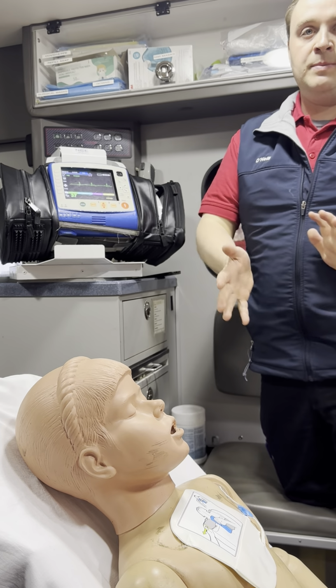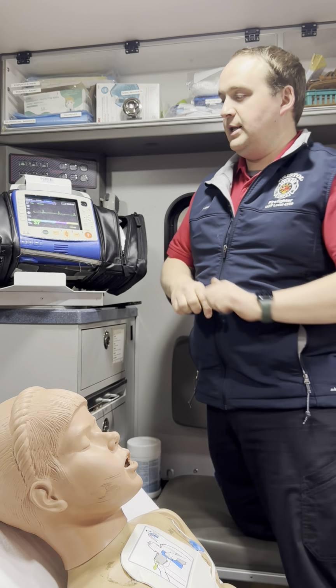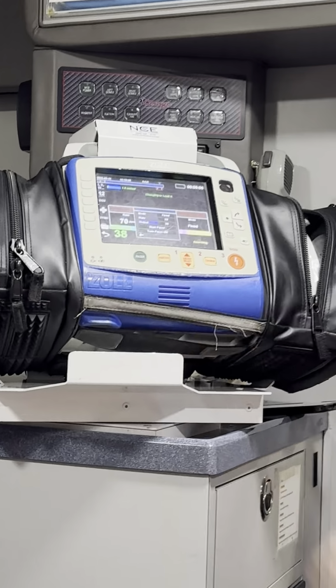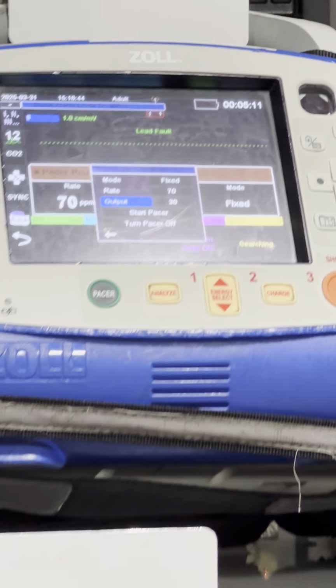Very important, when we're pacing, we have to have at least the 4-lead monitor connected to the patient. It doesn't have to be a full 12. The 4-lead provides feedback to the monitor. At this time, we'll hit the pacer button, which will open up the pacer menu on the monitor.